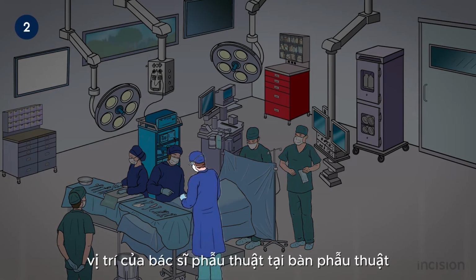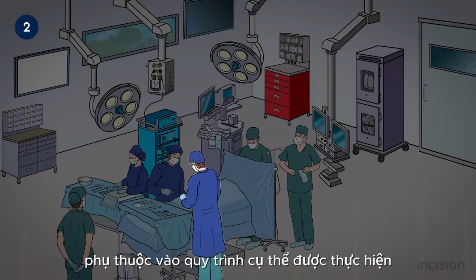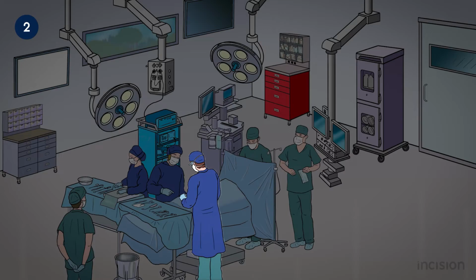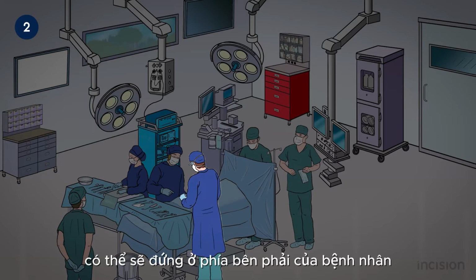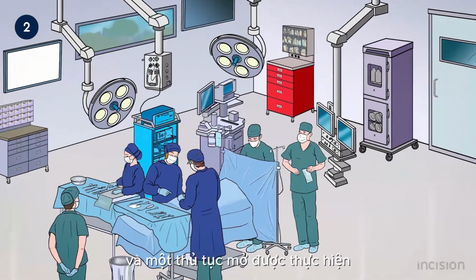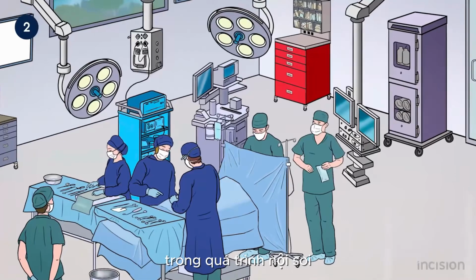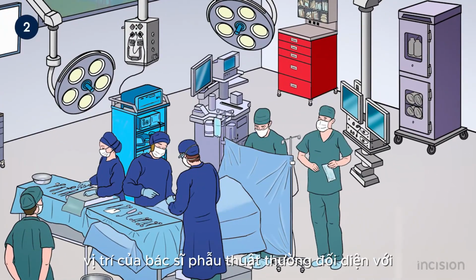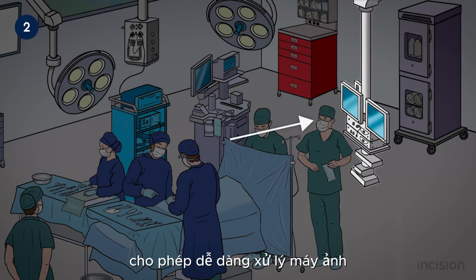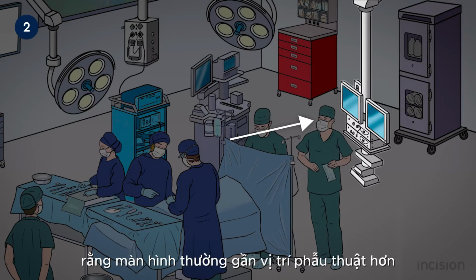The position of the surgeon at the surgical table depends on the specific procedure to be performed. It may also depend on the dominant hand of the surgeon. A right-handed surgeon will probably stand on the right side of the patient if the surgical site is centrally located and an open procedure is performed. During endoscopic procedures, the position of the surgeon is usually opposite to the surgical site. The monitor is usually located above the surgical site, allowing easy handling of the camera while looking from a certain angle into the direction of the screen. Note that the screen is usually closer to the surgical site.